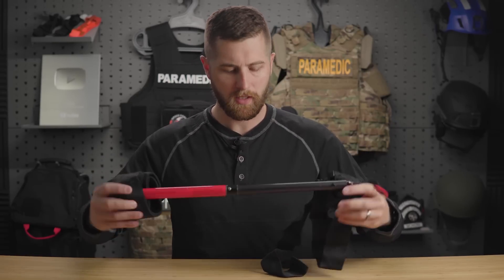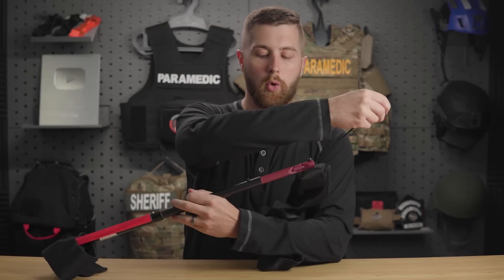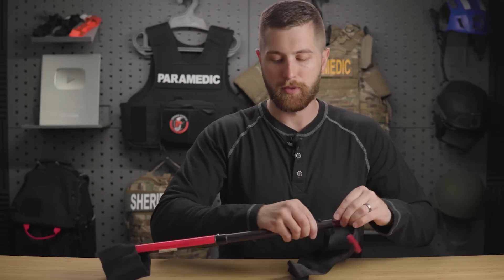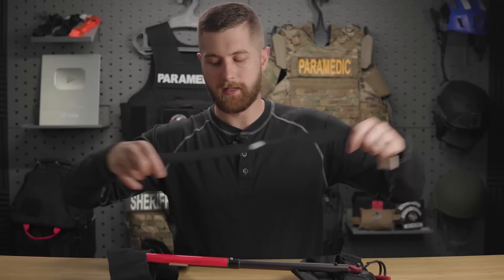This end goes up the groin, similar to pretty much every other traction splint on the market. Basically, this goes on the calf, this goes on the groin, you extend it out, and then you use this cord here to give it extra traction — it pulls traction on itself and gives you the leverage to pull those bone ends back together. This will then secure in the loop. Once it's secure, since you don't have an ankle strap, your foot is liable to rotate back and forth, which isn't good. So they've come up with an ankle strap that goes around both feet and wraps them together, keeping the feet side by side and providing rotational stability.